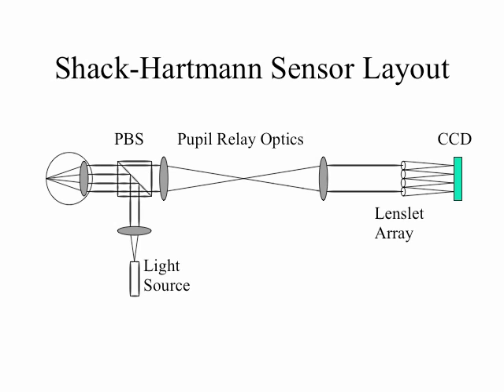And let's say that rather than a black sheet of paper, we've got a CCD because we're very fancy. Let's say that CCD is 1/10 of a meter from the cardboard disc with the apertures. Into each aperture we're going to put a little +10 lens so that the rays of light passing through each aperture will converge to a point. Now, the only reason that we're doing this is to make the little pinpoints of light on the CCD more precise, smaller, so that it facilitates more precise measurement between the spots. But that doesn't change the optics. It's just to aid in getting a measurement with the CCD.